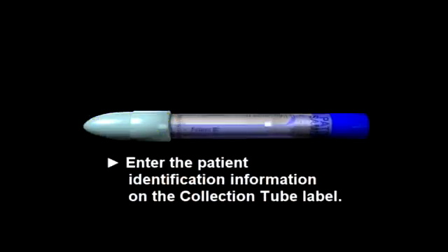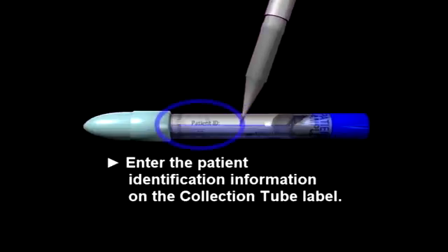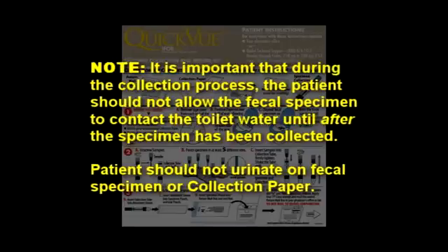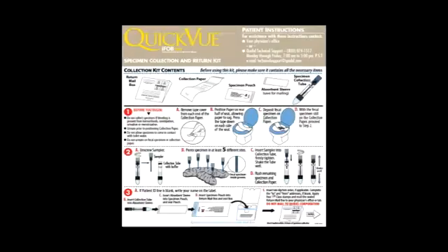Enter the patient identification information on the collection tube label. Note: it is important that during the collection process, the patient should not allow the fecal specimen to contact the toilet water until after the specimen has been collected. Patients should not urinate on fecal specimen or collection paper. The patient will follow the procedure outlined as follows.